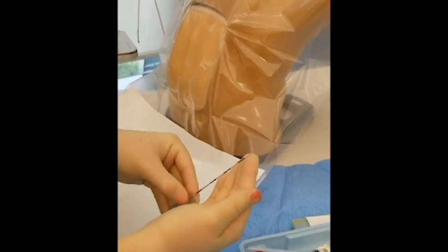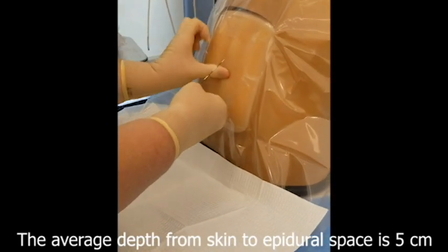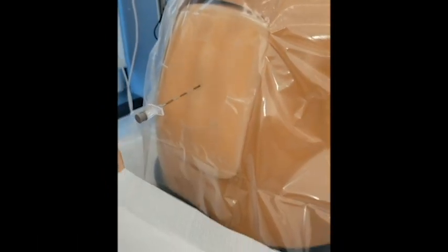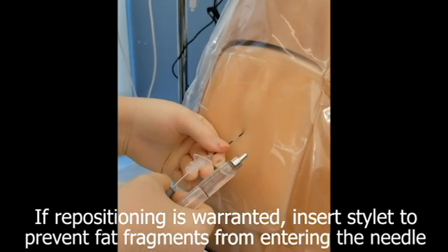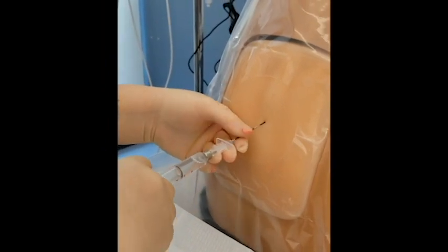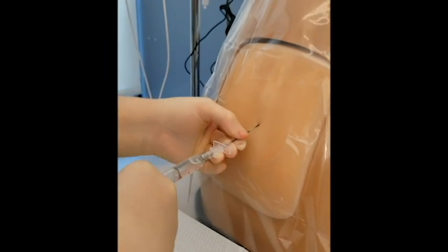And take your Tuohy needle and insert at the skin wheel about 2 to 3 centimeters until you feel ligamentum flavum. You will go through supraspinous ligament and interspinous ligament first. Remove stylet and apply the glass syringe.